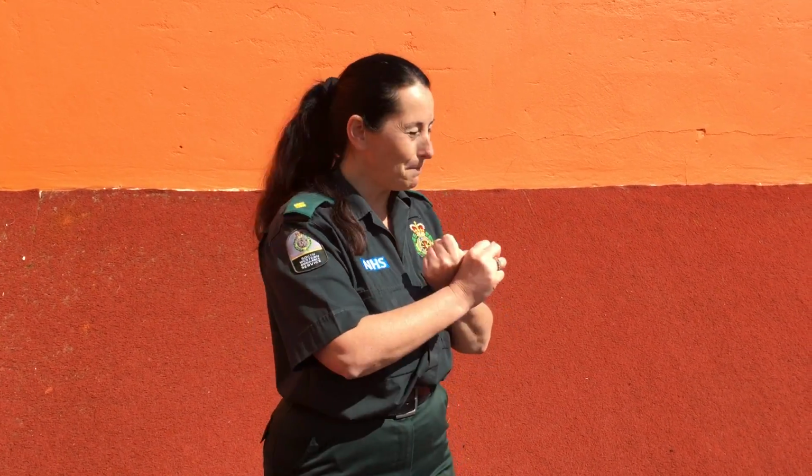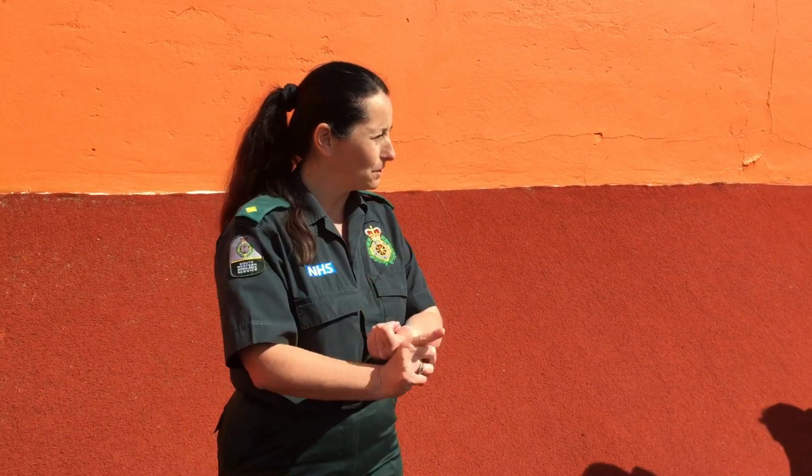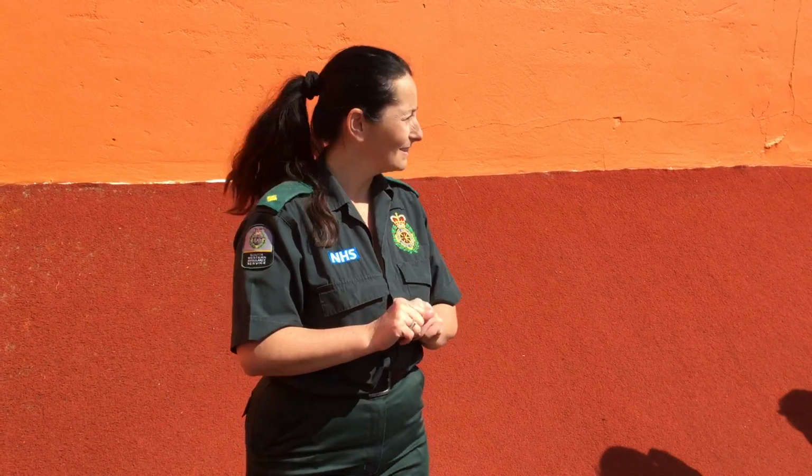Pacemaker, yes. I'll go through them in a minute, but you've got pacemaker. Pregnant is not one of the P's, but it's a good one because you don't treat pregnant ladies any different. You still put the pads on. You still shock them. Anything else?